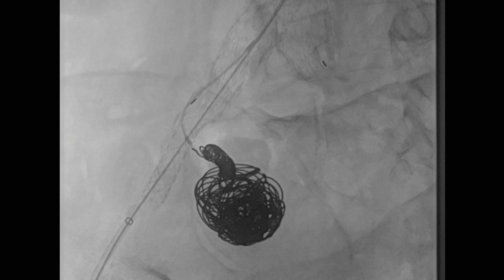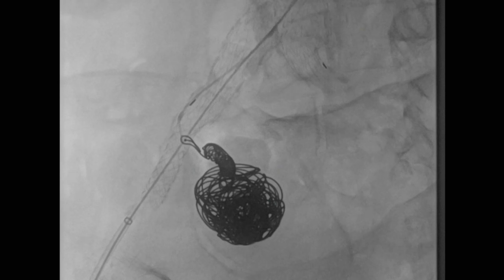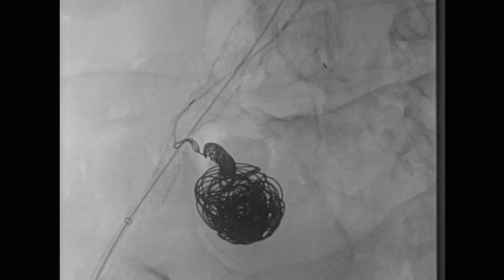At this point we're very happy and we want to detach the coil — and it won't detach. It's probably because the delivery system has a little hook, and normally these disengage but we couldn't get it off. Here's what you really don't want to have happening: starting to drag the coil back. The VBX extends about a centimeter up beyond the origin, but there's really not much you can do. You just jiggle the catheter backwards and forwards and hope that it disengages. It's almost like the hook of the detachment system has grasped a loop of that coil and will not let it go. I managed to pull that coil back a little bit, and then suddenly it released.